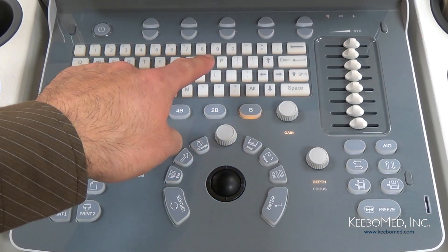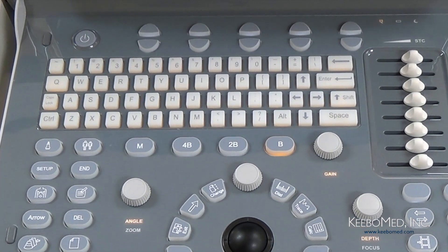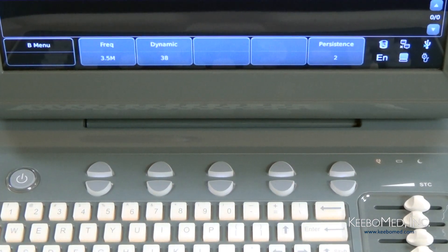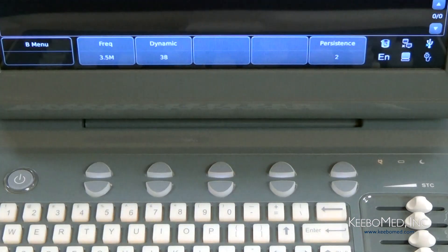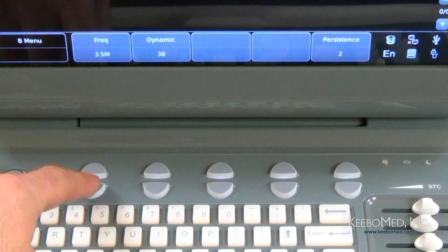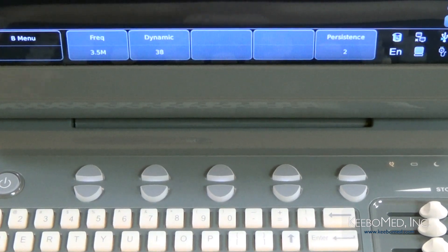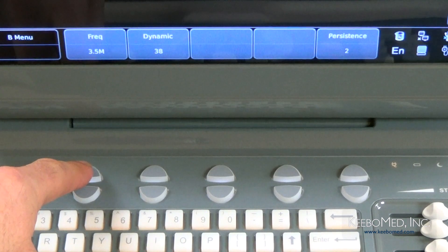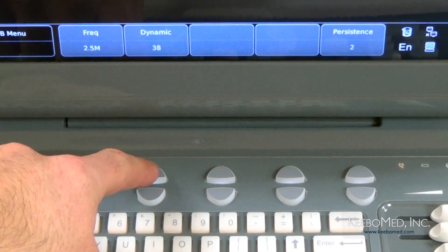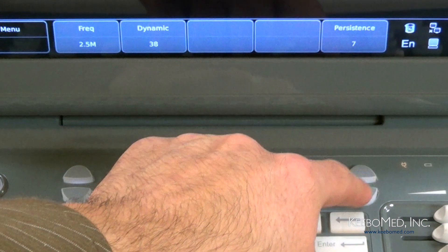The keyboard is a full-function keyboard, very similar to one found on a computer, which makes it very easy to use. Above the keyboard is a group of keys used to control specific parameters — these controls depend on what functions are being used at the time. Each set of keys corresponds to a specific function that can be increased or decreased by pressing up or down. For example, in B mode we have probe frequency that can be changed up or down, dynamic that can be adjusted up or down, and persistence that can be adjusted up or down.